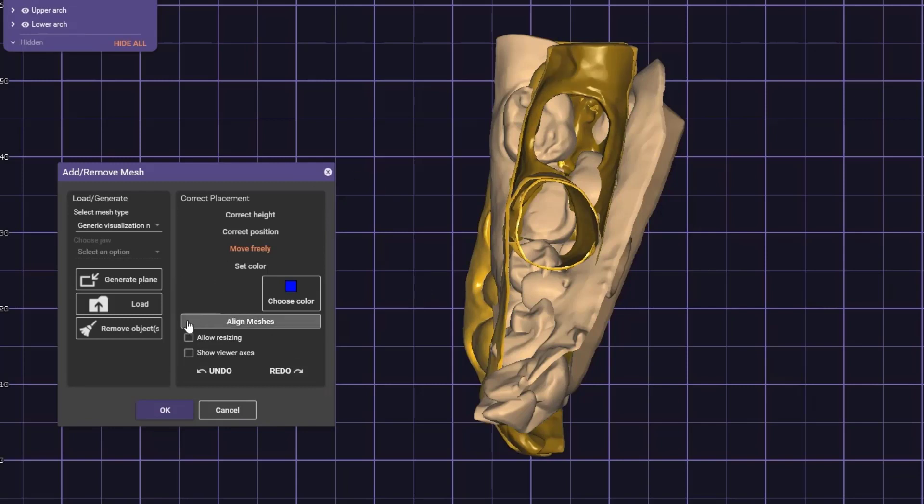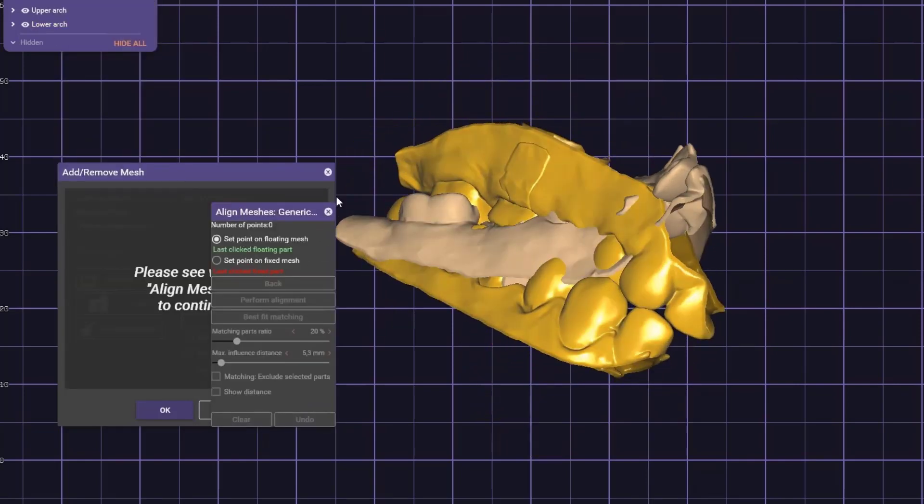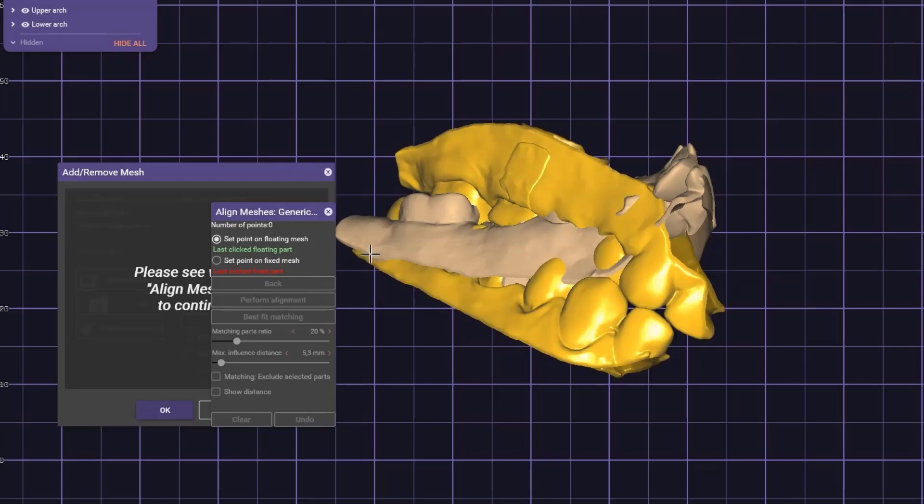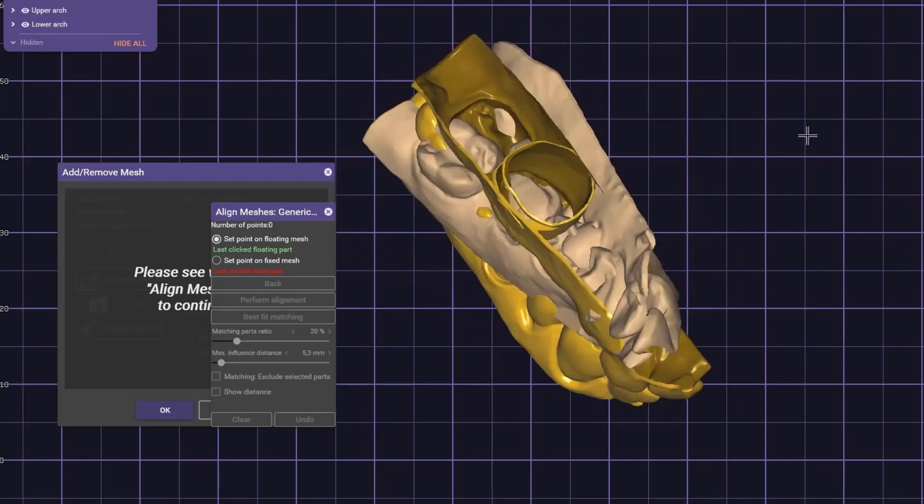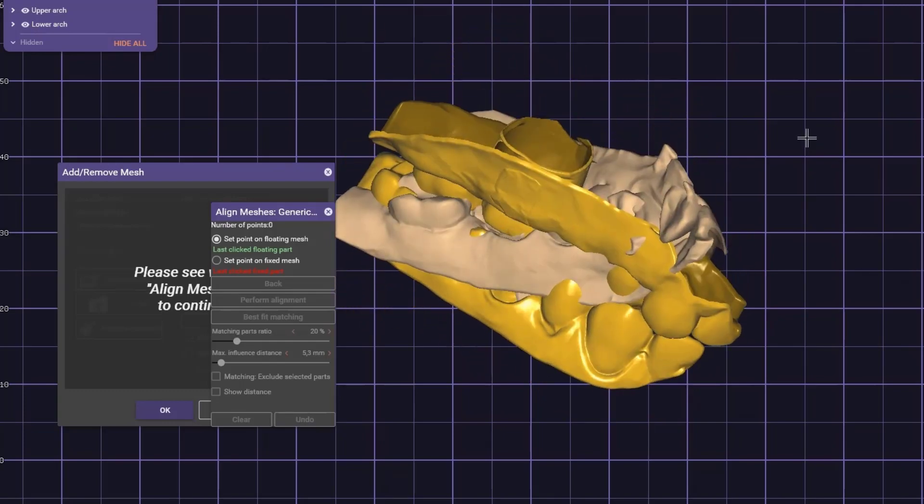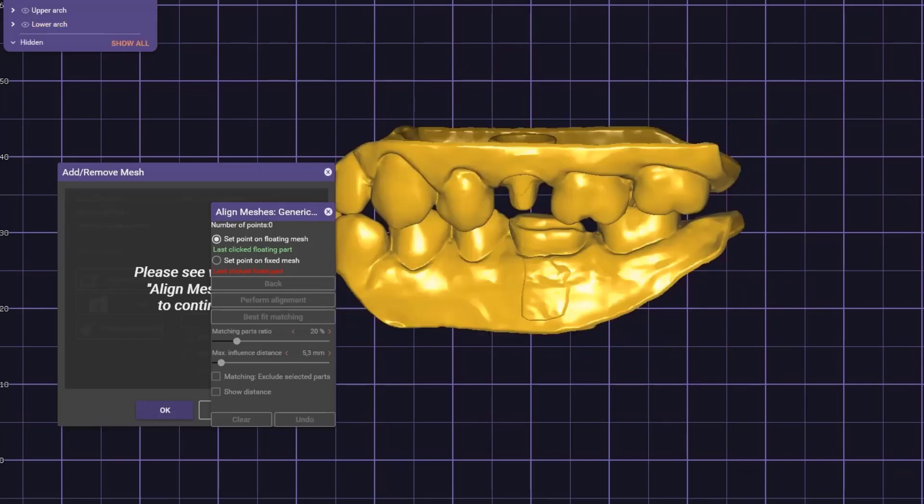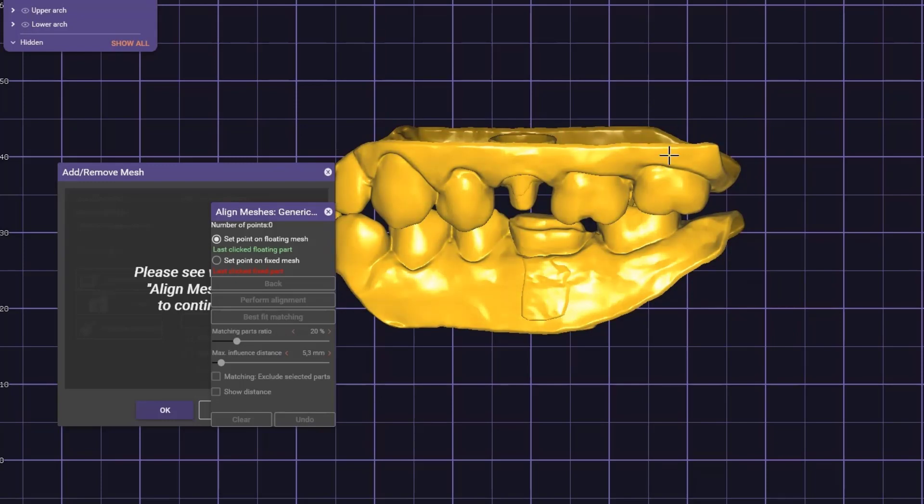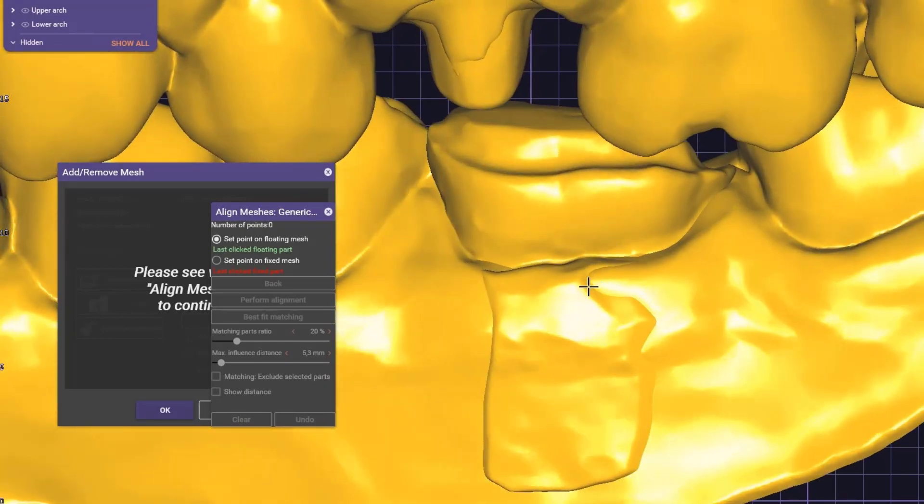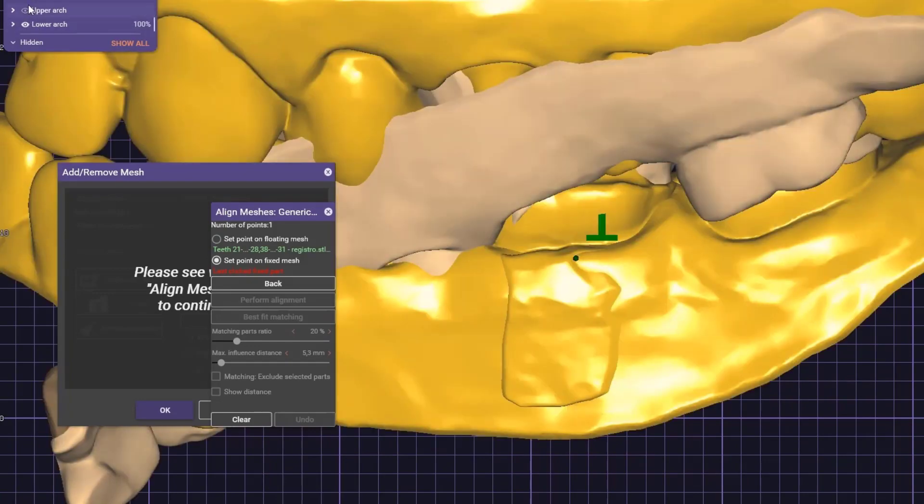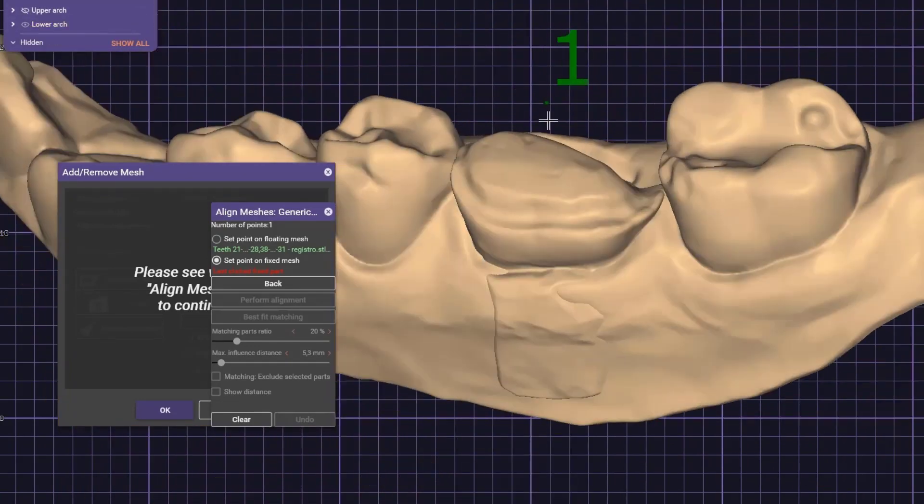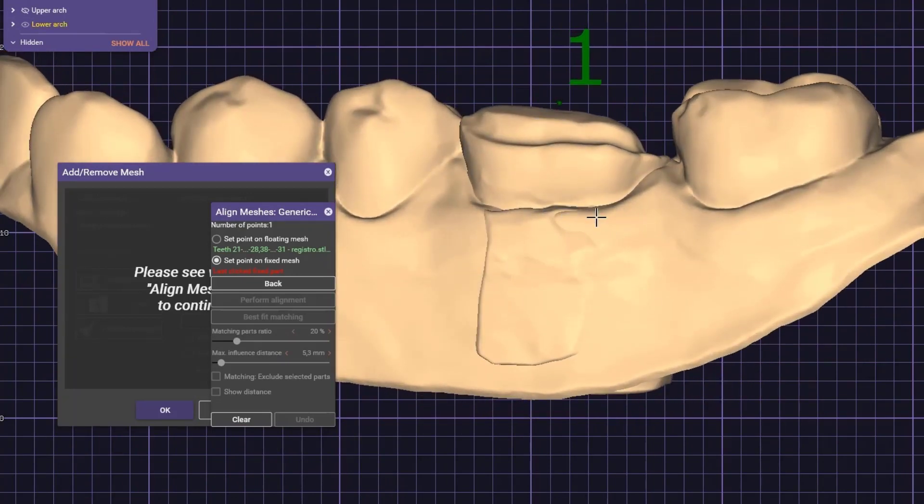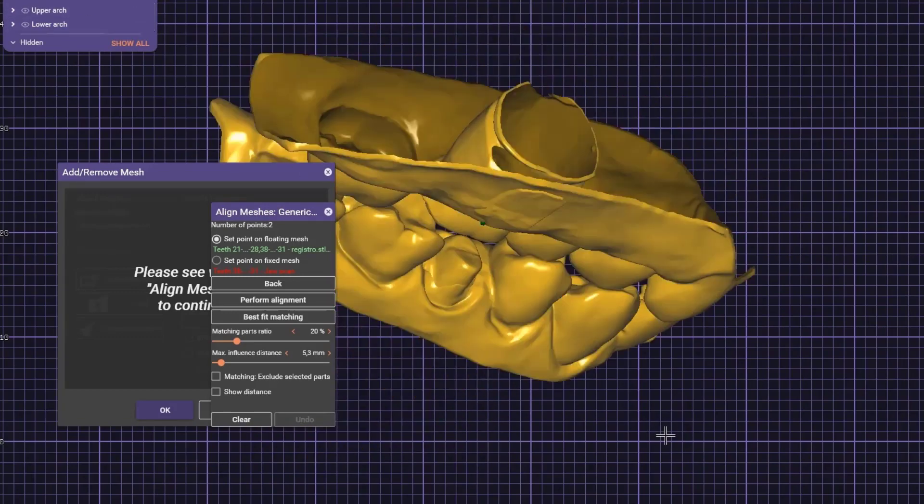Now we're going to hit on align matched meshes. This is very important. The floating mesh is the one that is going to move, and the fixed mesh is the one that will stay still. In this case, we're going to put the bite scan on the lower jaw first. To move the floating mesh to the right position, we have to put one point on the floating mesh and one point on the same position on the lower jaw. We do this three times in a row.